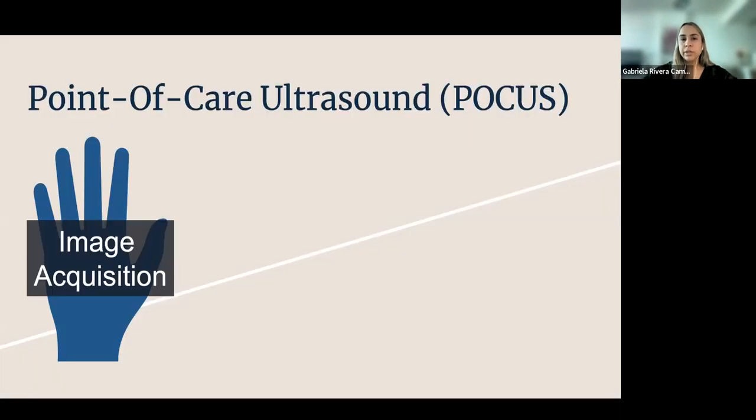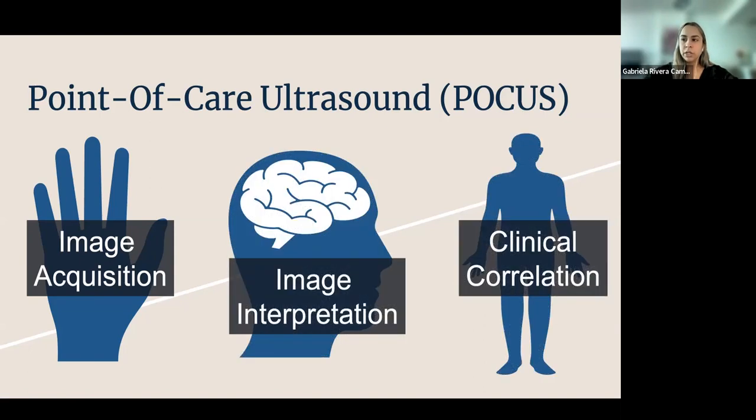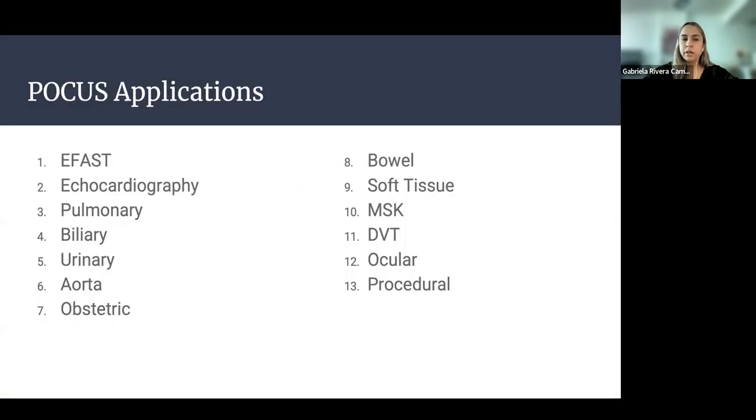So differently than radiologic diagnostic ultrasound, physicians that perform point-of-care ultrasound are responsible not only for image acquisition, but also for image interpretation and the clinical correlation. So these are several applications that we can perform with point-of-care ultrasound. This lecture will discuss the basics of the EFAST exam.